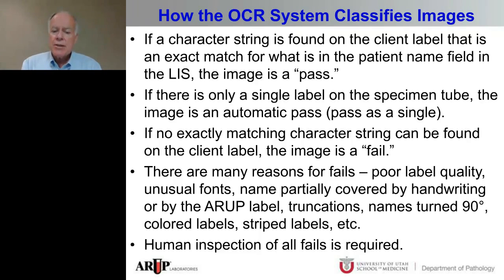If there is a client label on the tube, but it has no exactly matching character string that can be found, the image is a fail. However, it doesn't mean it was a mislabel. There are many reasons for fails.